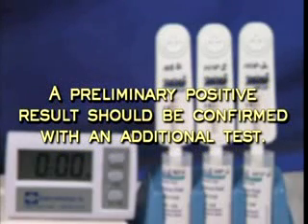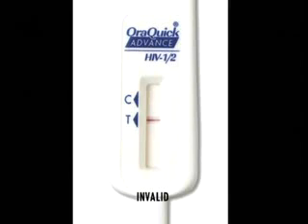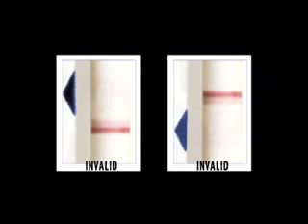A preliminary positive result should be confirmed with an additional test before a patient can be conclusively diagnosed as HIV-positive. People whose tests show either a negative or a preliminary positive result need to receive counseling to help them understand what the result means. Proper counseling procedures should be administered. A test is invalid if no reddish-purple line appears next to the C triangle, if any of the lines are not inside the C or T triangle areas, or if a red background in the result window makes it difficult to read the results after 20 minutes.